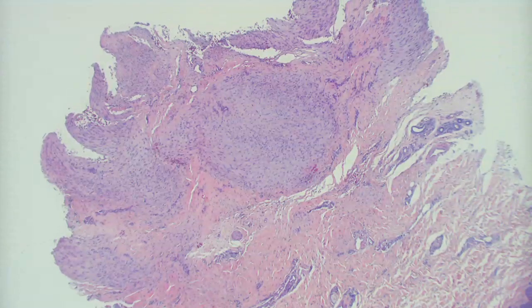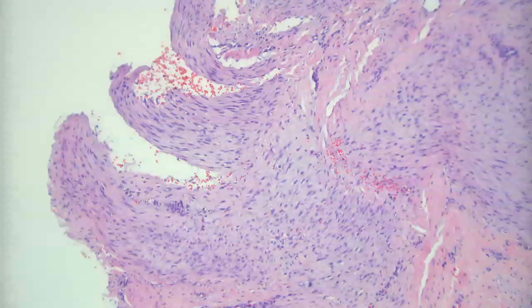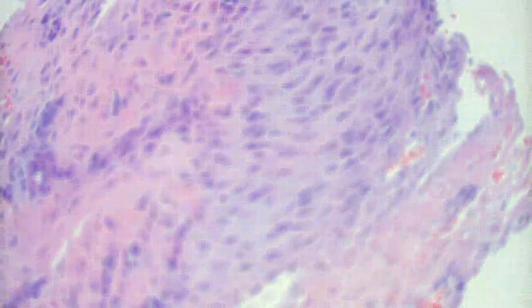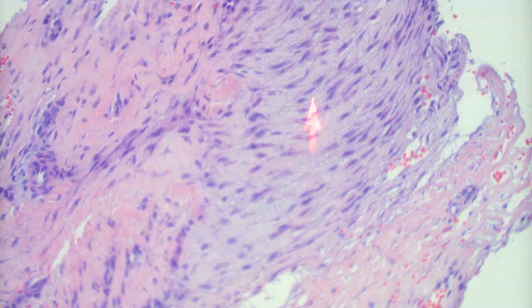Now, of those types of spindle cell lesions, which is the most common, or do you favor in this case? Well, there's a differential for this, and maybe this one has a myxoid look to it, a bluish hue. Good. So I can see the bluish hue, and then probably fibroblasts.